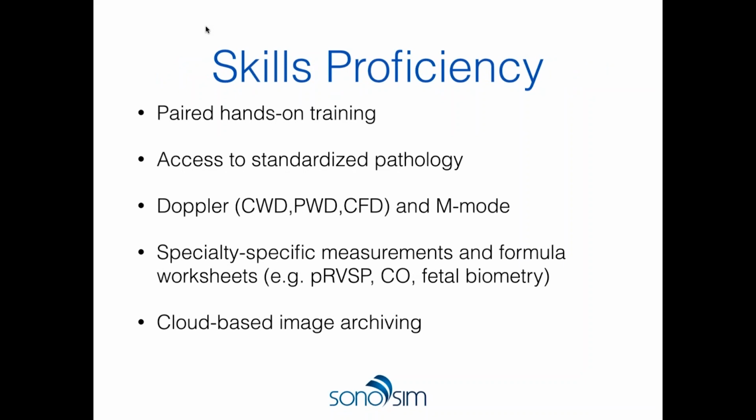So next we move on to the skills proficiency. And that's where simulation can really play a significant role. Again, if you consider the fact that you would need, let's say just for a cardiac session, a patient with a cardiomyopathy or perhaps right heart strain in the case of a pulmonary embolism, or a pericardial effusion if you're wanting to teach tamponade. You would need those 3 patients just for those 3 applications, enough machines for all the students that you have that are cycling through. You need to repeat that session over and over again, and that's just not possible.